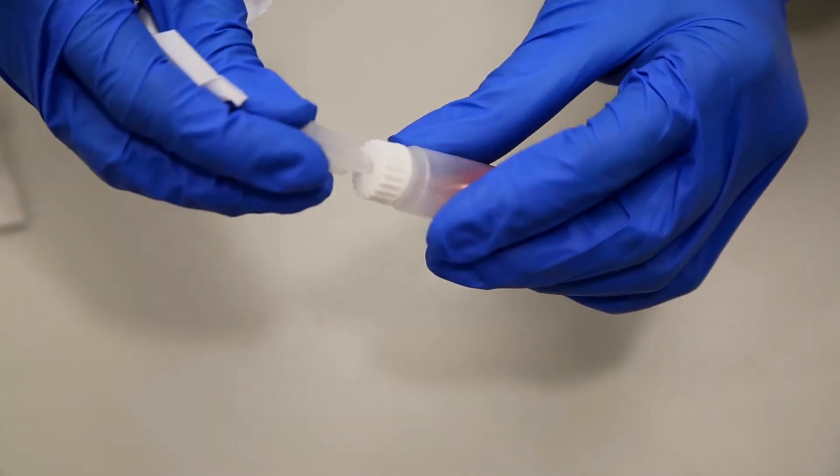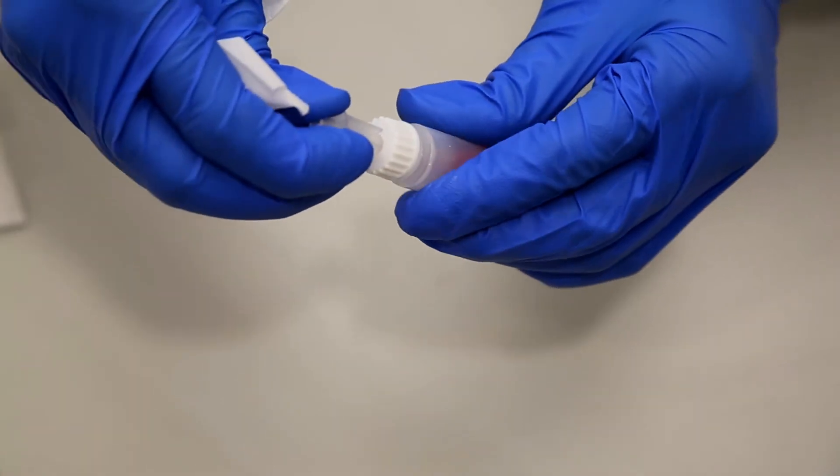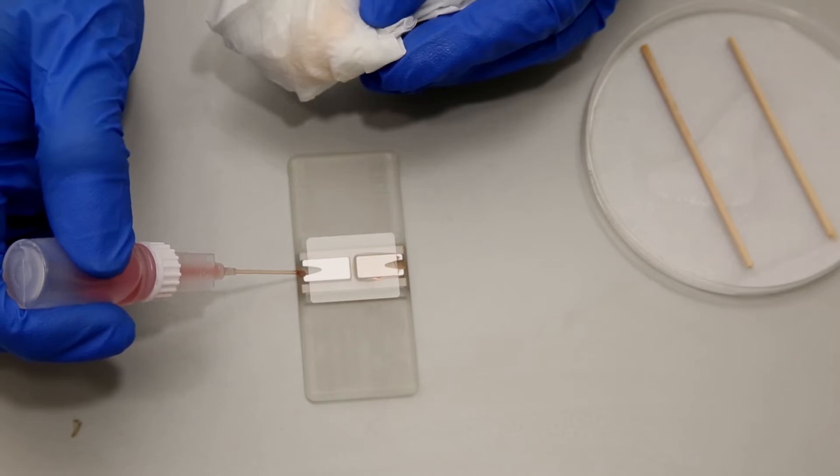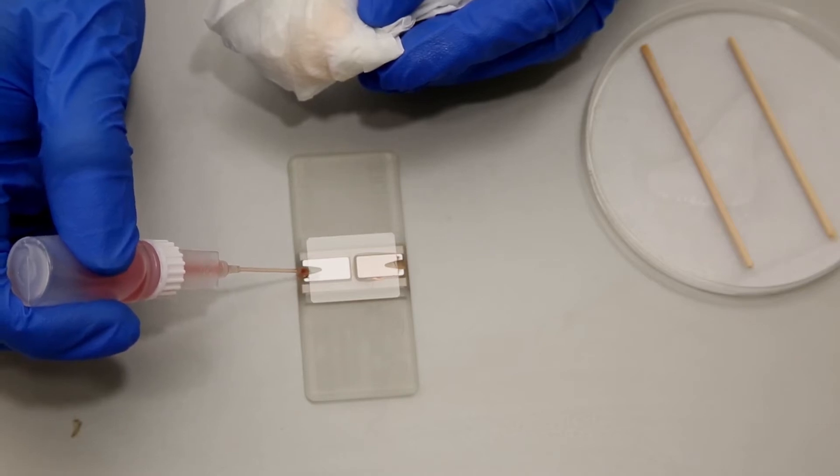Whole blood is added to the diluent, which lyses the erythrocytes while preserving leukocytes and platelets. When lysing is complete, the diluted blood is loaded into the hemocytometer for counting.